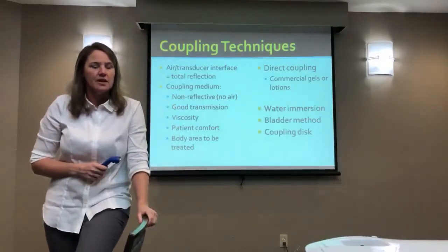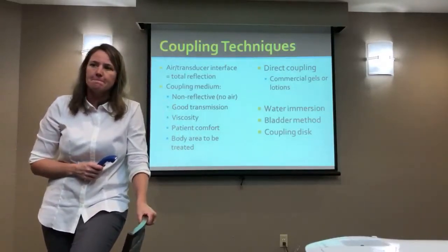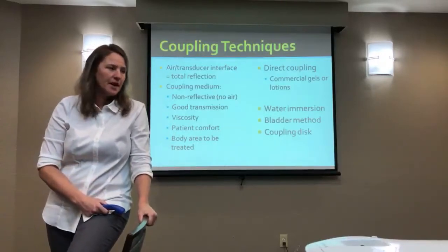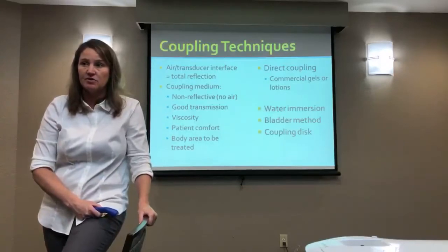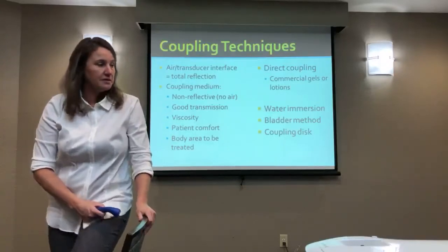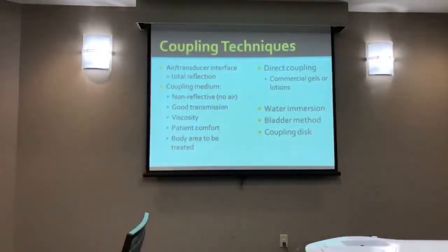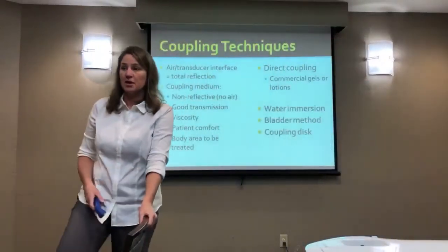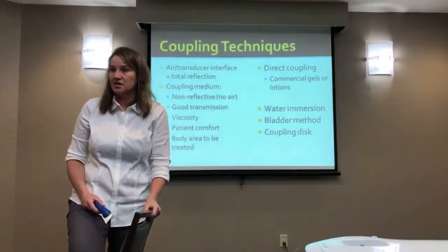Do most of the gels, are they okay for sensitive skin? Yeah, they're primarily water. I've never heard of anyone having any kind of an altered reaction, but that could come a day. It could come a day. Generally though, yeah. Okay. I'm just looking to see what it actually says on it. Yeah, no, it doesn't actually have all the ingredients, but my understanding is it's primarily water. That's a question I've never been asked, but I'll look what the ingredients are to just see is there anything.